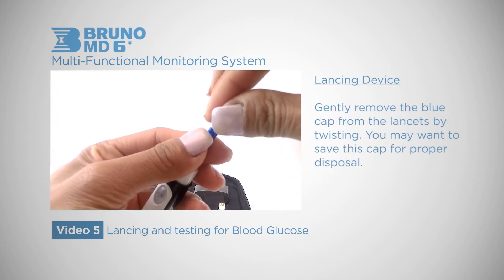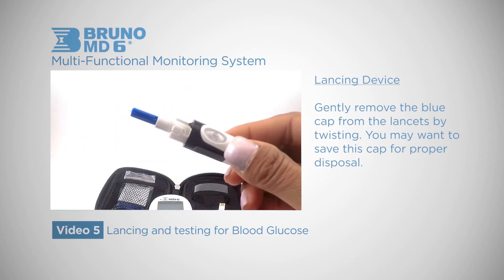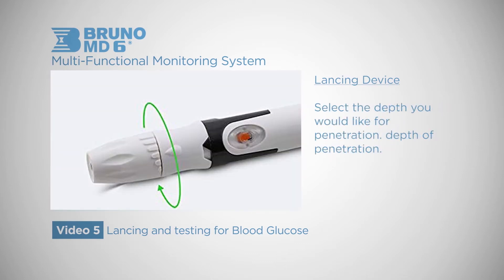Gently remove the blue cap from the lancet by twisting. You may want to save this cap for proper disposal. Place the cap back onto your device and gently twist up until you hear a locking sound. Select the depth you would like for penetration. If this is the first time you are using the device, you can work your way up or down the dials, fine-tuning your process to your preferred depth of penetration.